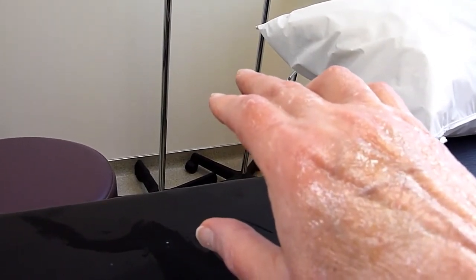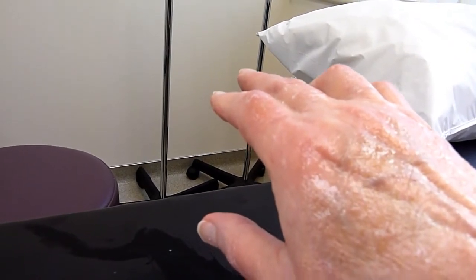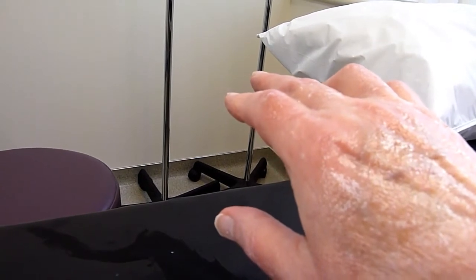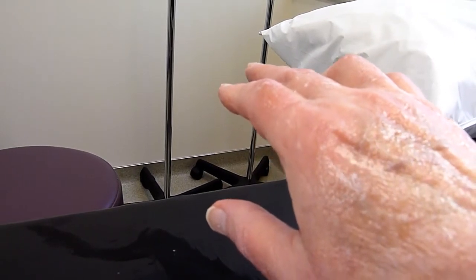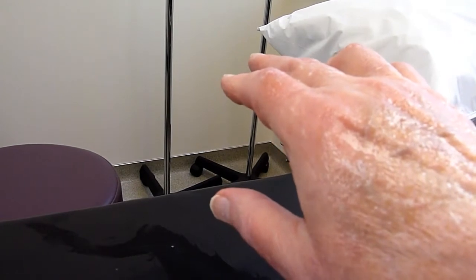So now when we do this, you're going to be a helper in 3 ways. Okay. The first way is I put some numbing medicine in, and at times I might ask you if the pad of your fingers is feeling numb. Yep. The second way that you help me is at times I might ask you to gently bend the tips of your fingers. Sure. I don't want full fist making. I just want tip bend.